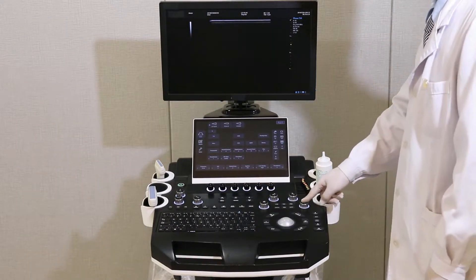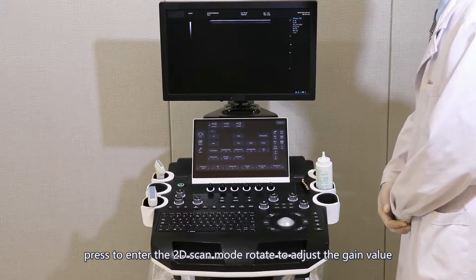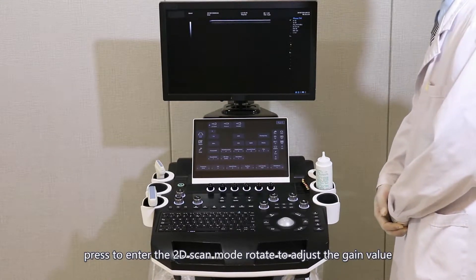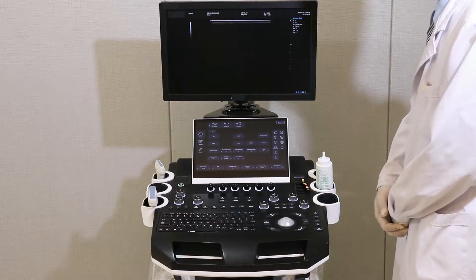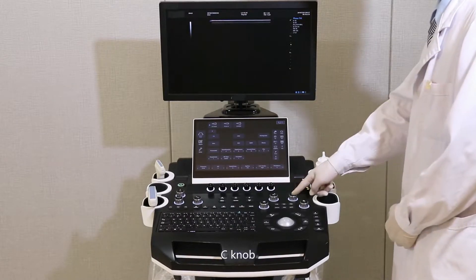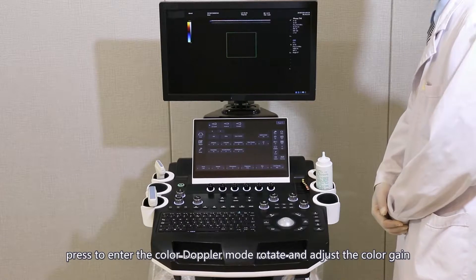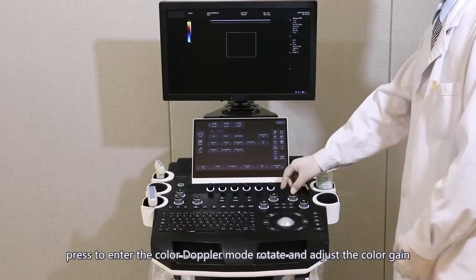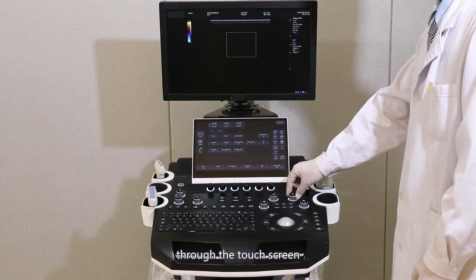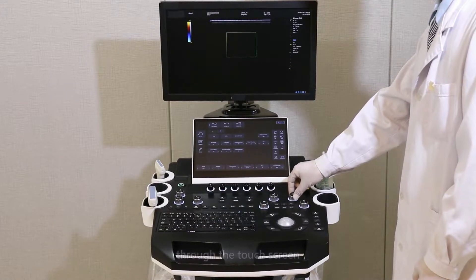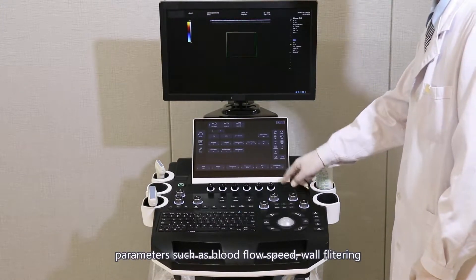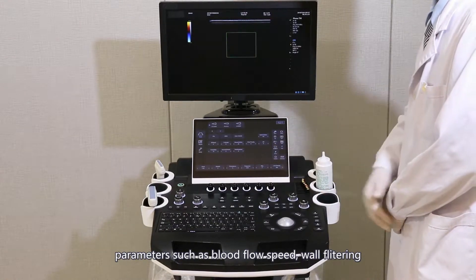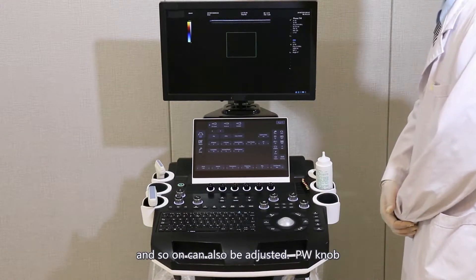B-knop: press to enter the 2D scan mode; rotate to adjust the gain value. C-knop: press to enter the color Doppler mode; rotate to adjust the color gain. Key parameters such as blood flow speed and so on can also be adjusted through the touch screen.